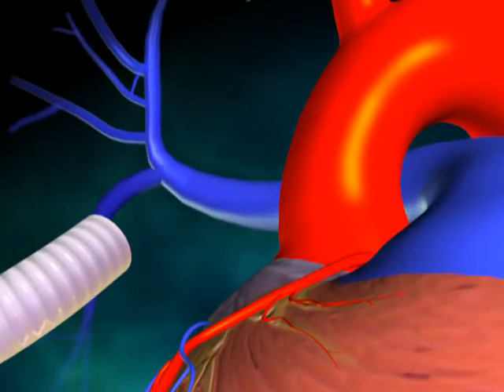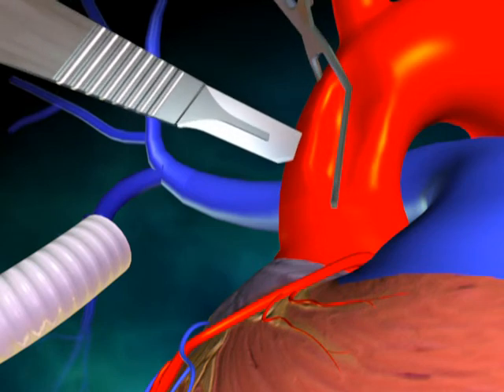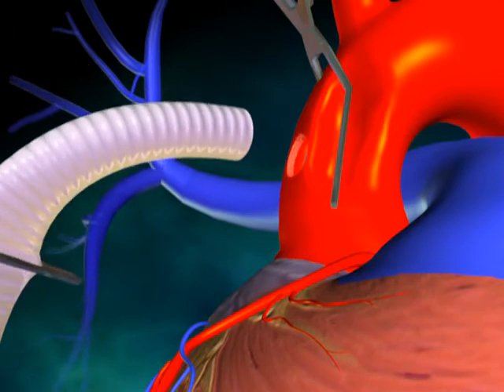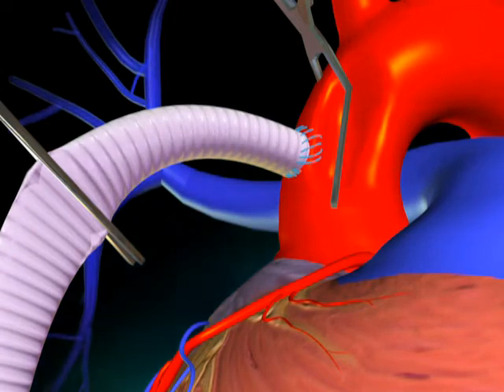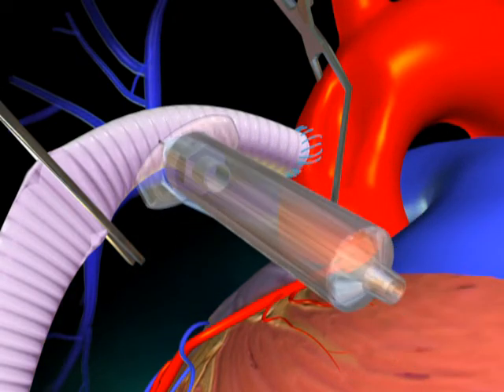A partial occluding clamp is now placed on the lateral ascending aorta, and a longitudinal arteriotomy is performed such that the outflow graft may be inserted and secured with 5-0 Prolene suture. Remove trapped air from the outflow graft utilizing an 18-gauge needle and syringe.